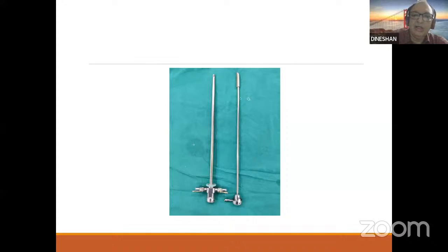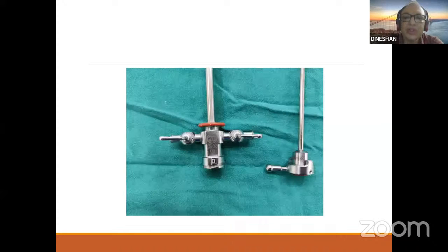And here there is a difference between the 17 French obturator and the other obturators. All other obturators are longer than the 17 French. The 17 French obturator is short and rounded. This is our oval. These are all longer ones. The 17 French obturator doesn't have a groove at the tip. This photograph doesn't show that.